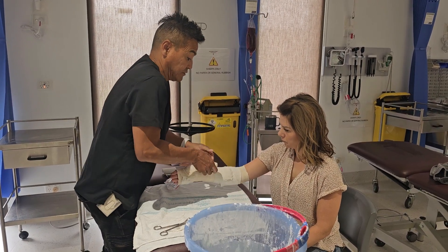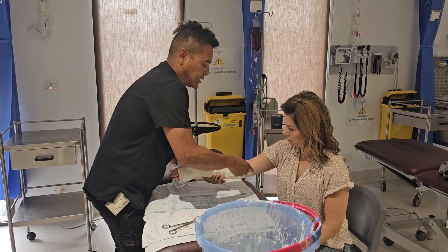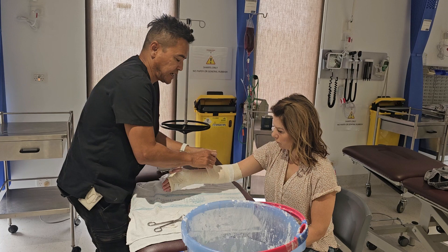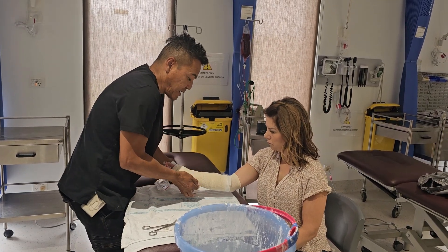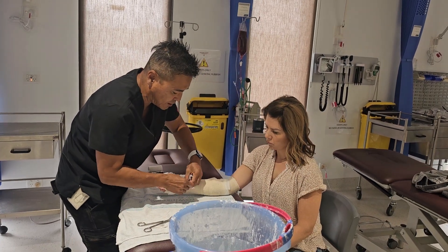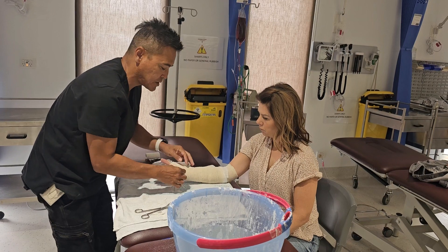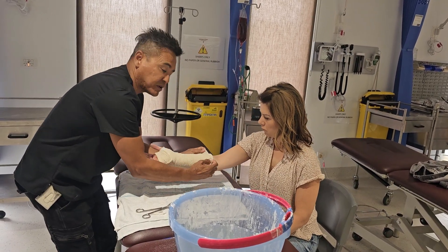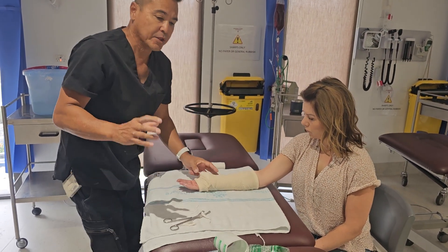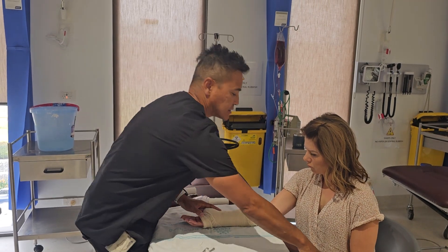I apply a fair amount of tension with the bandage. When dealing with fractures, especially recent ones, compression seems to be quite relieving and is a way of managing pain control. We're doing this in the context of a fracture clinic, not pressure immobilization for envenomation. I'll usually tape the bandage down as well. It's important that the stockinette folds over the plaster edge, because the plaster can be a little sharp and you don't want anything sharp on the skin.